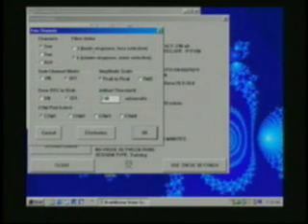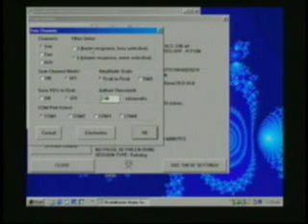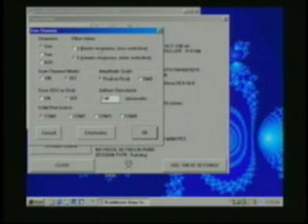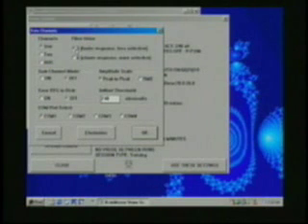Here's where we choose the filter order and this is the sharpness of the filter cutoff. Third is a faster response but a less selective filter, good for beginners.